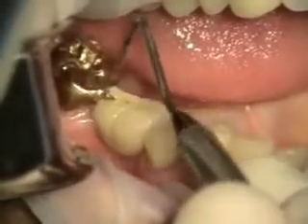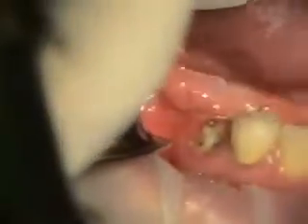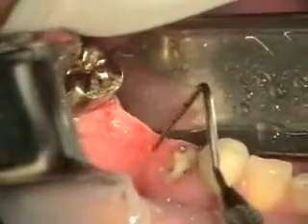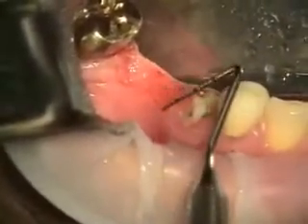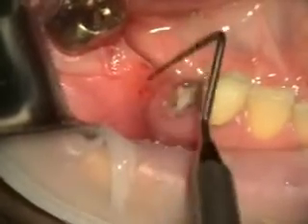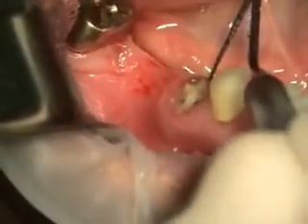Right now what we're going to do initially is just section a bridge. What we're looking at too is the amount of keratinized tissue that she didn't have where the flap is, but hard to tell. This looks like keratinized tissue here, so actually she has enough keratinized tissue. What I thought I would do was make an incision at the mucogingival junction and then apically position it, split thickness, and see if we can gain some more keratinized tissue. But actually she has enough here that I can split this and move this later, so I'm not so worried about that.